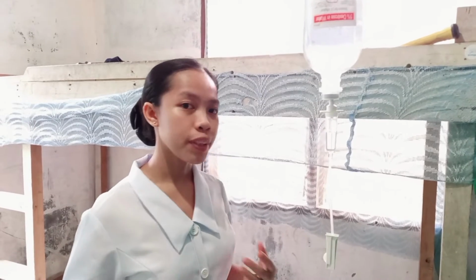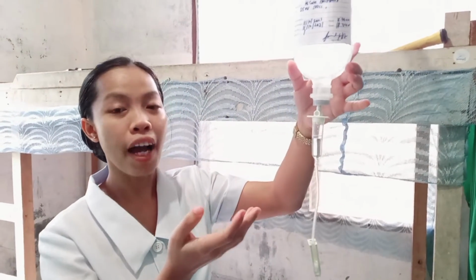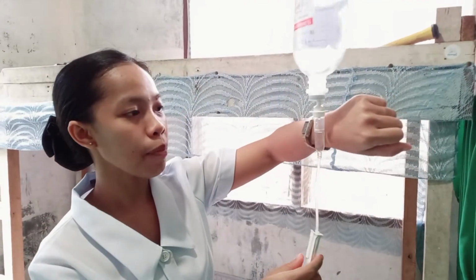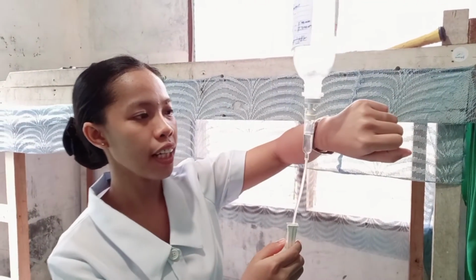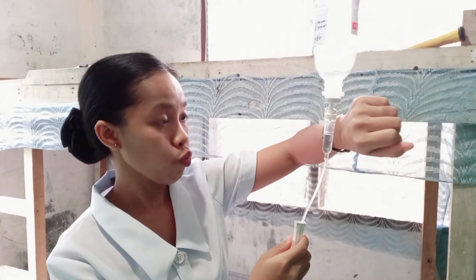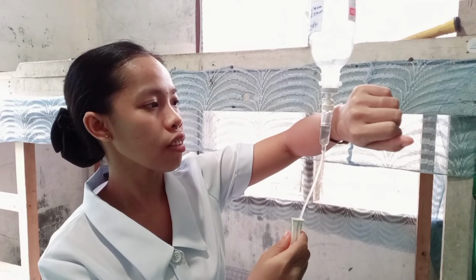After computing the flow rate and placing the IVF label to the IVF, we will regulate by placing our watch close to the chamber of the microset or macroset, and we will match the drops to our watch.